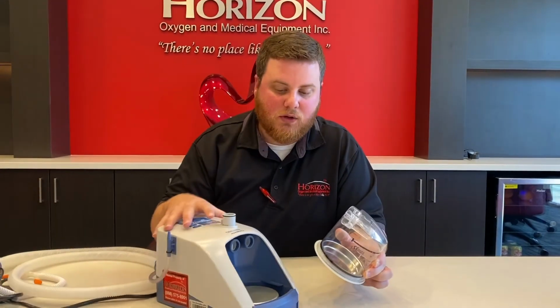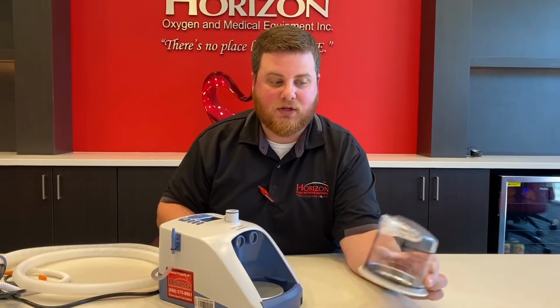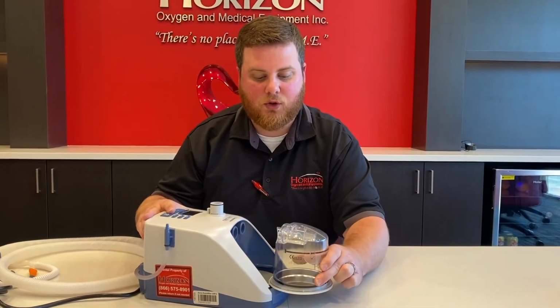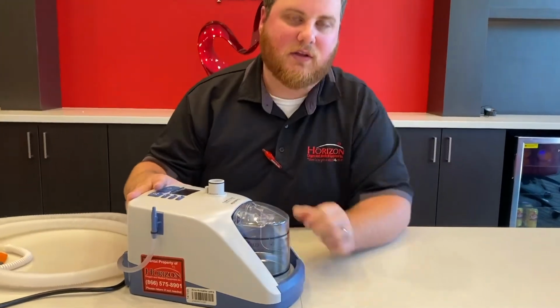If you have a patient utilizing this, they need to add more water, all you gotta do, you can leave the machine running. You detach this, quickly pour water into the humidifier chamber, and then you bring this right back. You hold the whole humidifier in place and slide it in until it snaps into place.